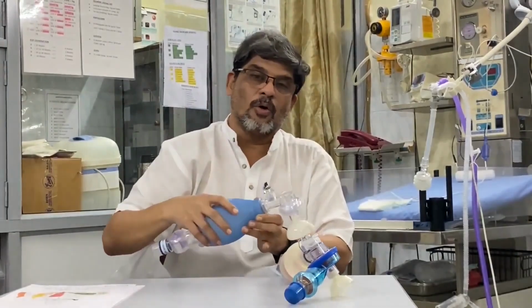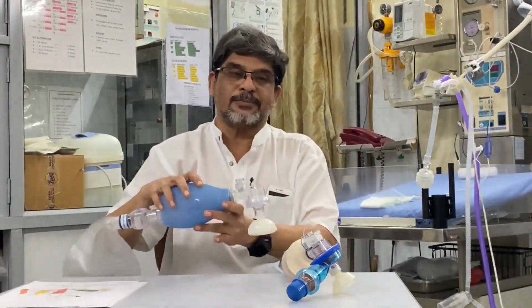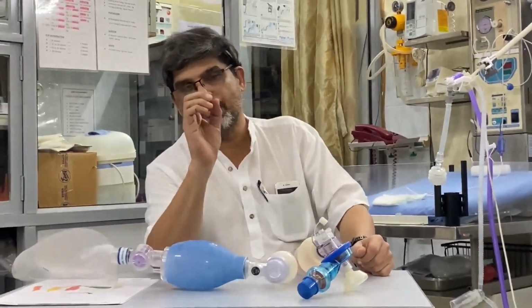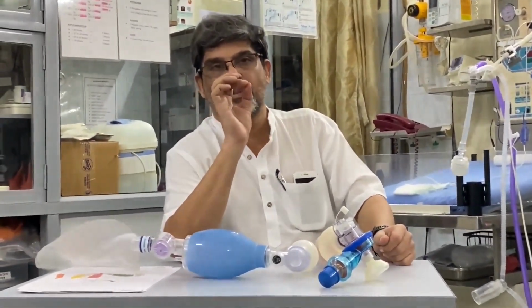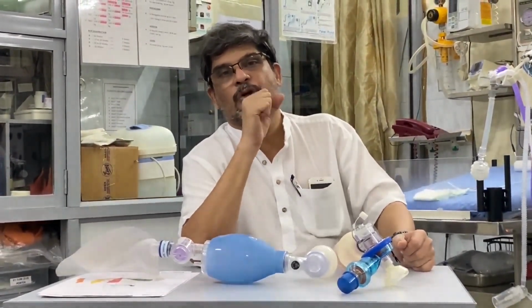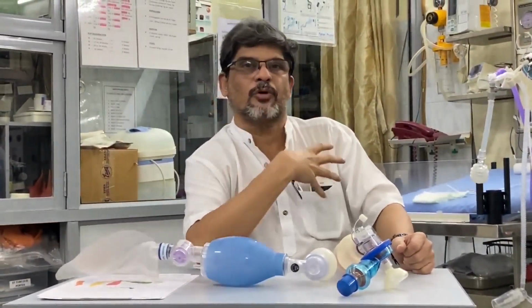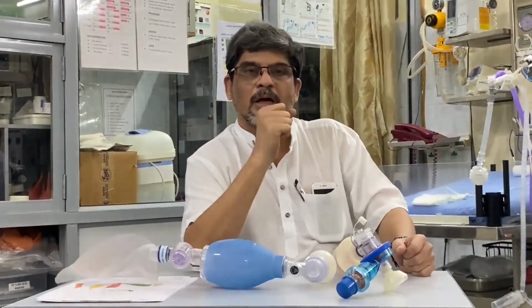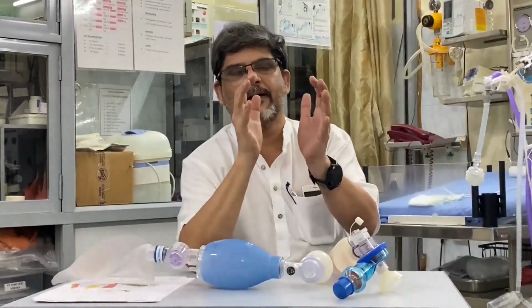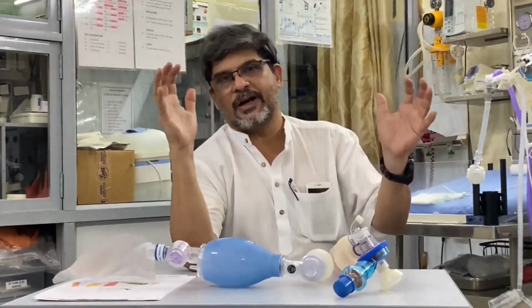Now, what is the role of PEEP? That is most important. Take an analogy of a birthday balloon. When you try to inflate the balloon, initially you struggle and have to generate a lot of pressure, so the work done for inflating the balloon is too high initially. Once you inflate it a little, it keeps on inflating with little pressure.